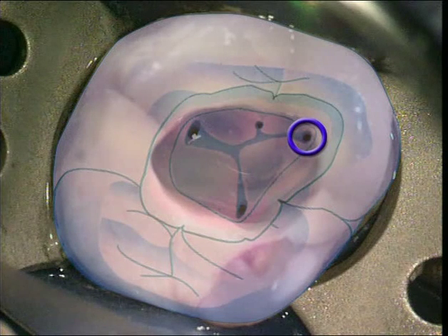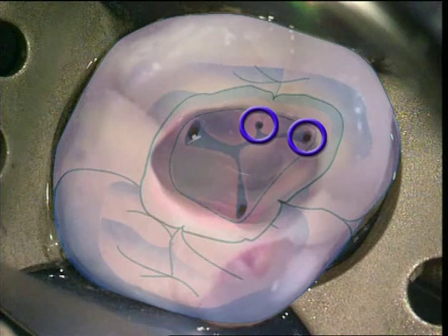Studies have shown that the mesiobuccal root manifests two root canal systems in approximately 90% of cases. By carefully removing secondary dentin towards the palatal side of the mesiobuccal orifice, an MB2 system can often be found with the endodontic explorer.